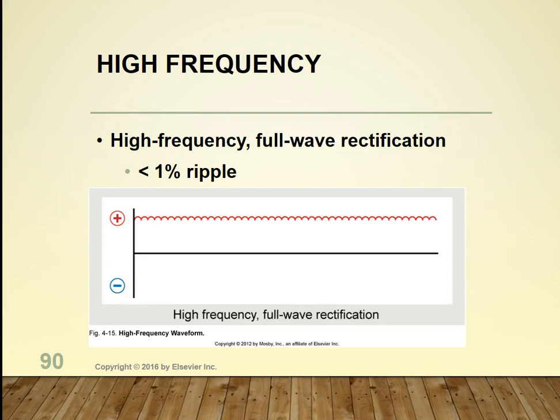But when it's time to get something new, just think about it like your iPhones. If you were on an iPhone 5, but you finally need to replace it, but we've already got an 8 out, or 10 if you want to go that high, if you could afford it, you'd go on up to the 8 and get the best that you could rather than just getting another 5 just because it could do it. So if that didn't make any sense, I apologize, but I want you to know that the differences in our generators are single phase that can have up to 100% ripple.